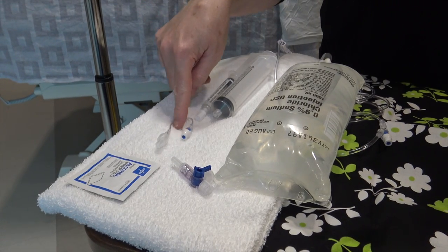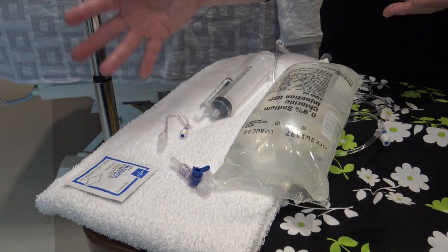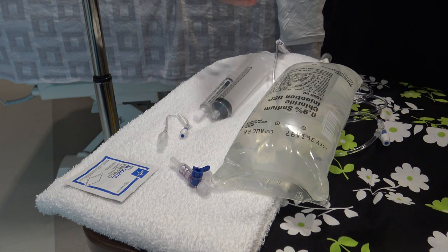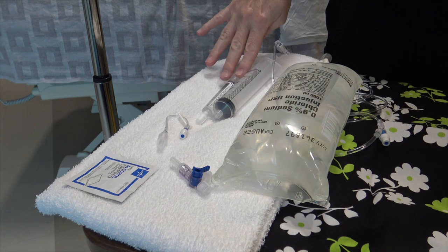a T-connector, which will be connected to your patient, any cleansing device or tools that you will use to clean the hubs, and also syringes. We typically use larger syringes, maybe a 40, 50, or 60 cc syringe for our larger children. For infants and smaller children, we might use a smaller syringe, but these are the supplies that you will need to deliver rapid IV fluid boluses.